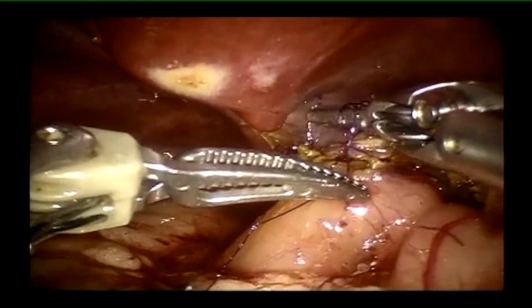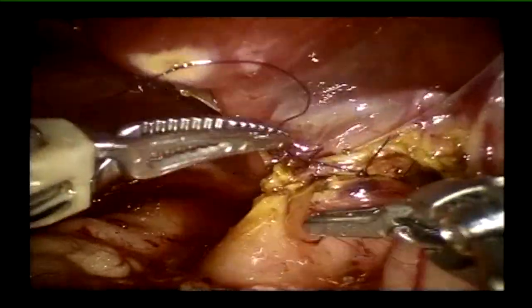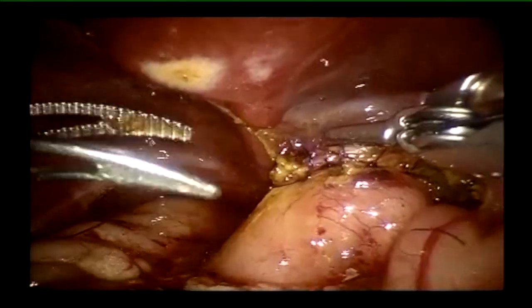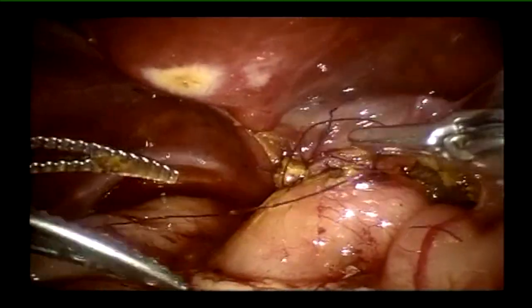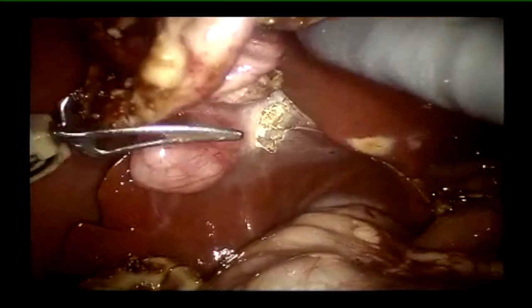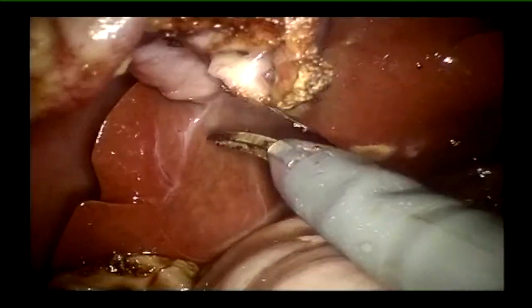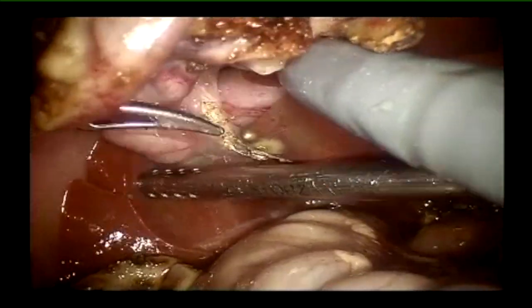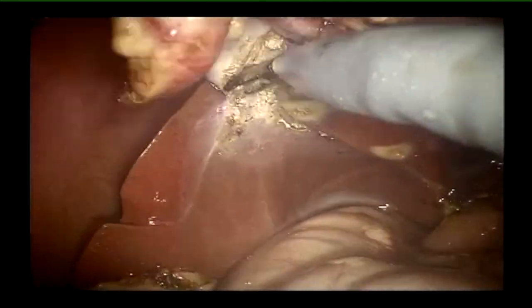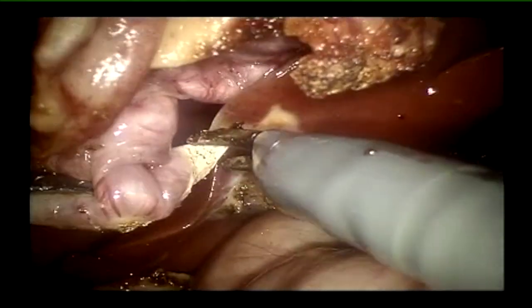I think this is a fair demonstration and a fair argument in favor of performing complex reconstruction using a robot in extremely small children — it is safe and effective. Just make sure you have the relevant amount of experience or a mentor in place when you attempt these surgeries at the beginning of your robotic journey. We also performed a cholecystectomy, do not close ports, close only the muscle, and use steri-strips for skin closure — giving us fantastic results. Begin your robotic journey as soon as you can.